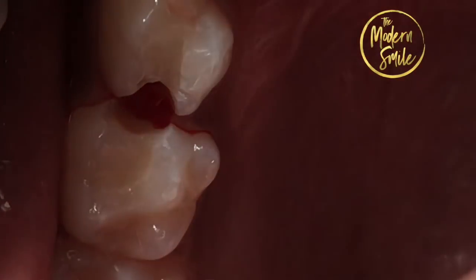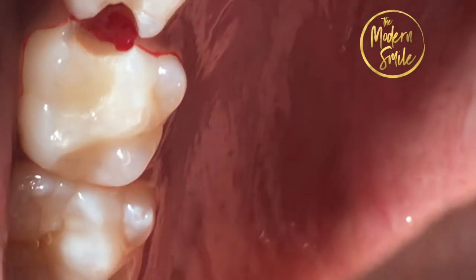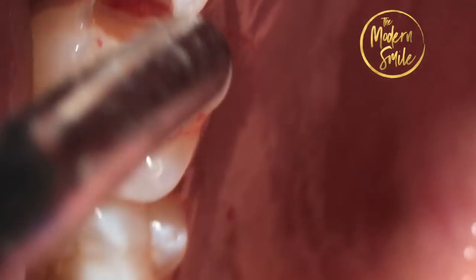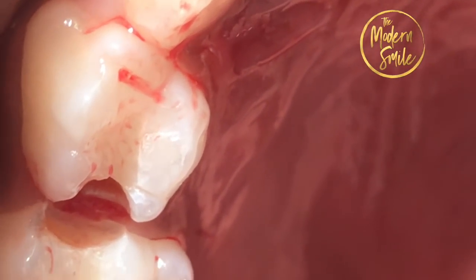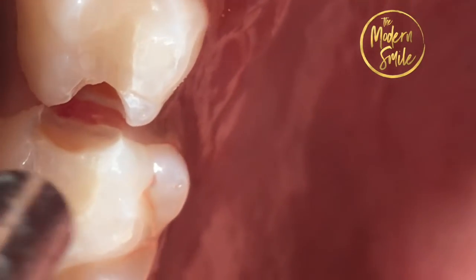You're seeing the prepared teeth. No more brown spots. Wherever the brown was, I've drilled it out. The bleeding is only happening because when I'm drilling, sometimes I touch the gums lightly, and because food is always in there, the blood will accumulate there, but that's not painful at all. So after all of that drilling, we're going to start to prepare to fill that tooth with a white filling. And remember, these are baby teeth.